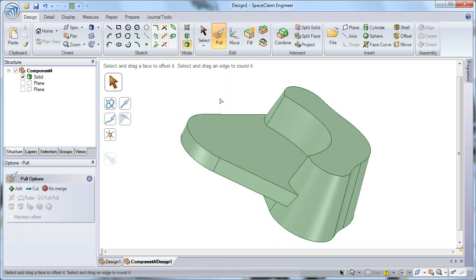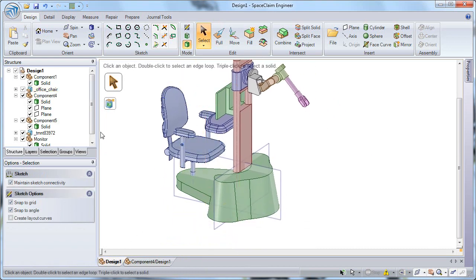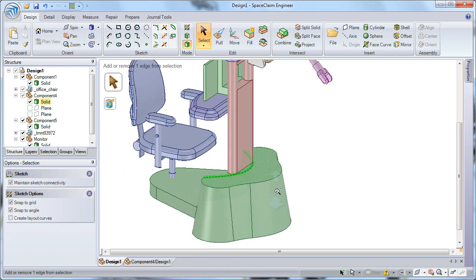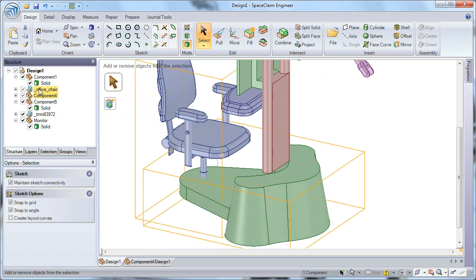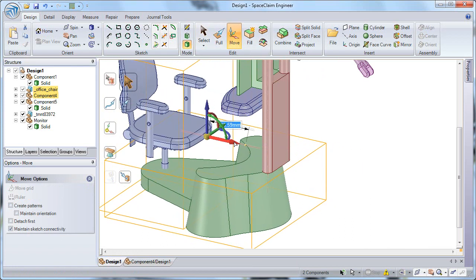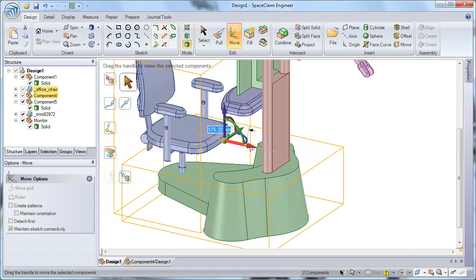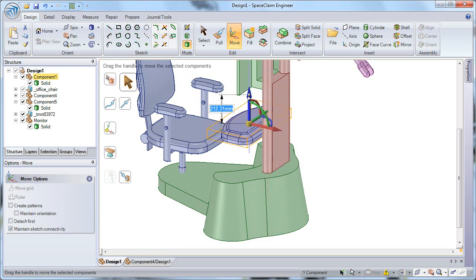So now that we've created our geometry for that base, we'll go back to our main design, and you can see that the geometry updates in our top-level assembly as well. Go ahead and hide the planes in the top-level assembly. We want to move these components to adjust for the changes we made. So let's select on our base component as well as our office chair component. And with the Move tool, we can move both of them simultaneously, horizontally, to center the mounting tower to the middle of the base. And then we'd like to select on our table, and we can translate that as well, translate that down to a more appropriate height.